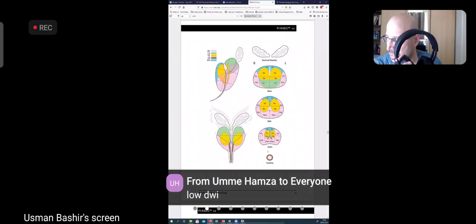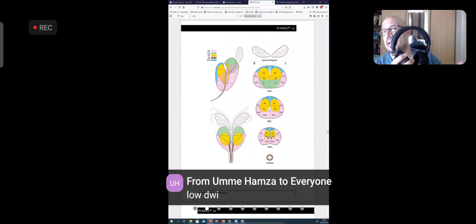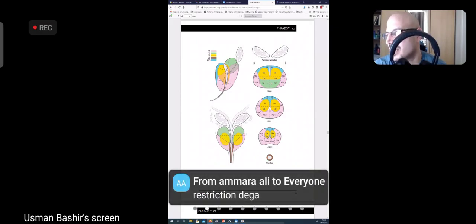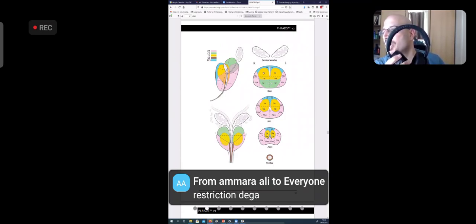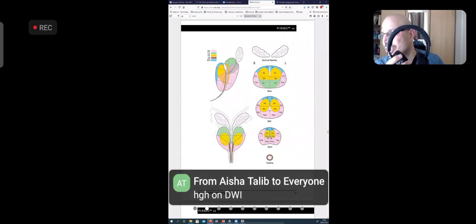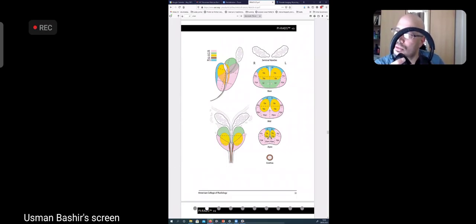और ये आपके रेफरेंसेस हैं कि लीजन आपको एमआरआई के किस सीक्वेंस में, किस स्लाइस में नजर आए, आप उसको co-localize करेंगे. I'm not going to go into it further because I believe it should be self-explanatory. All you have to do is, when you see the lesion, you draw a dot on this corresponding picture, identifying that lesion, arrow it and give it a PI-RADS score. And if it is going outside the capsule, you mention that or draw on that, in the image. So it's acr.org, PI-RADS v2.